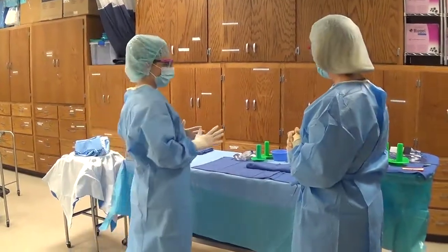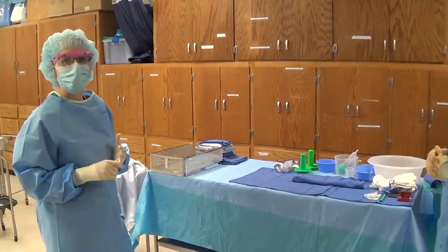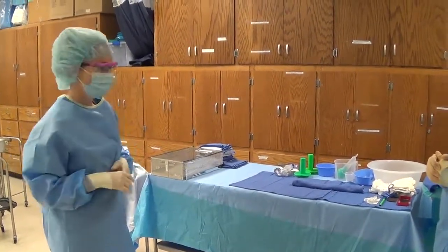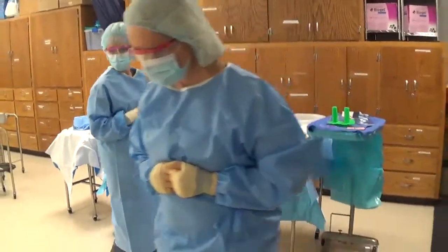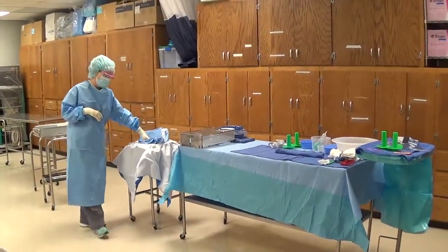This video is going to show some different scenarios related to draping and cords that students often struggle with, and just what we are looking for when we perform those tests. At this point you've gowned and gloved your surgeon, who will go on the other side of the patient, and then we're going to bring up the drapes which are inside the basin.